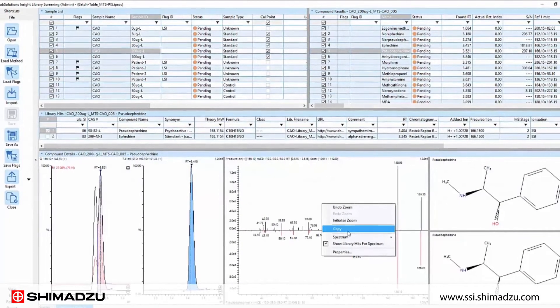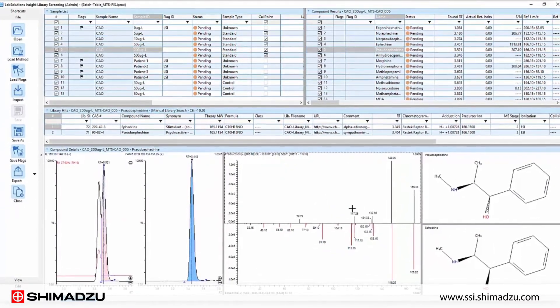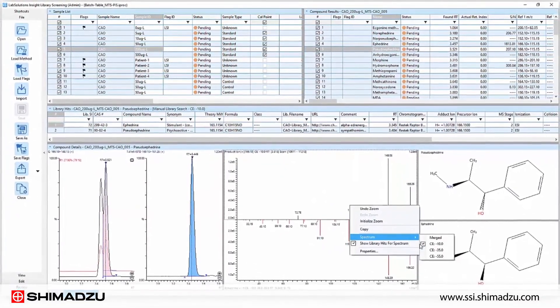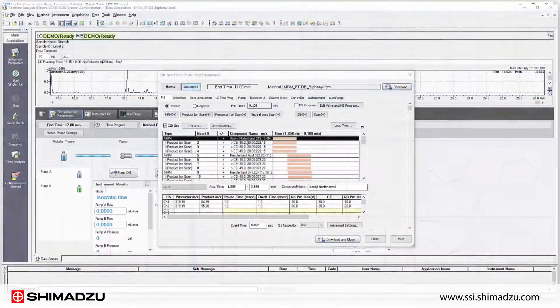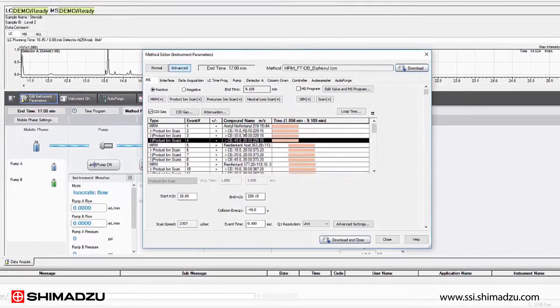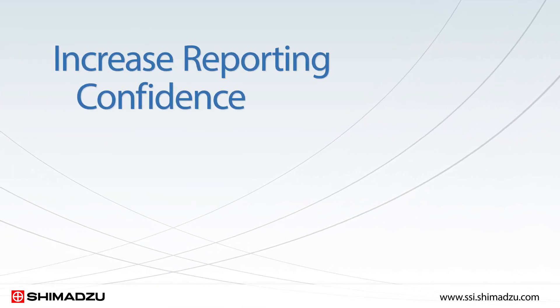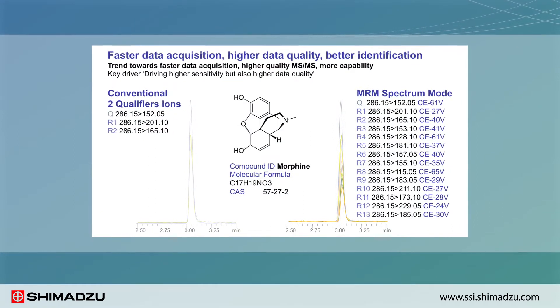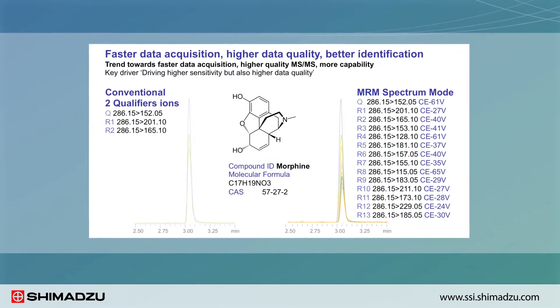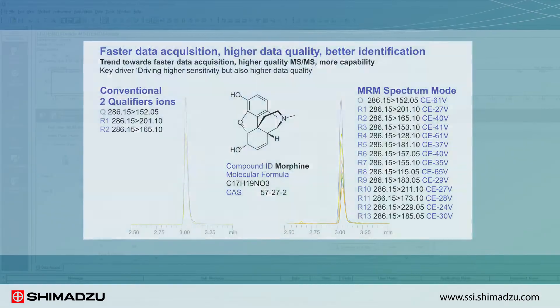Shimadzu's Lab Solutions Insight software uses three MS-MS spectra with three different collision energies to increase specificity and reporting confidence. The synchronized survey scan feature allows you to automatically trigger three different MS-MS scans for high quality spectral matching. Lab Solutions Insight also enables you to produce high quality results without the need to define a threshold value to trigger an alert, decreasing the chance of false negative and false positive reporting.